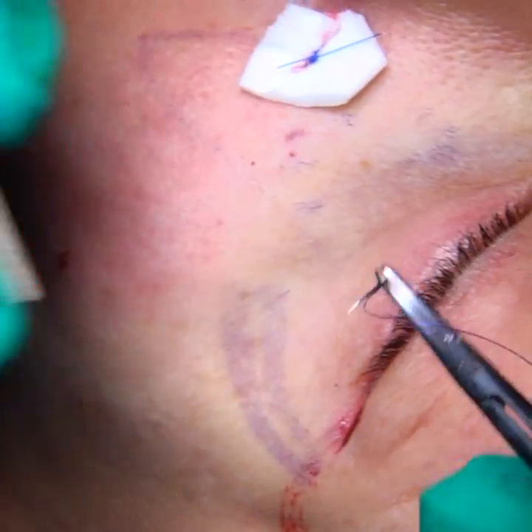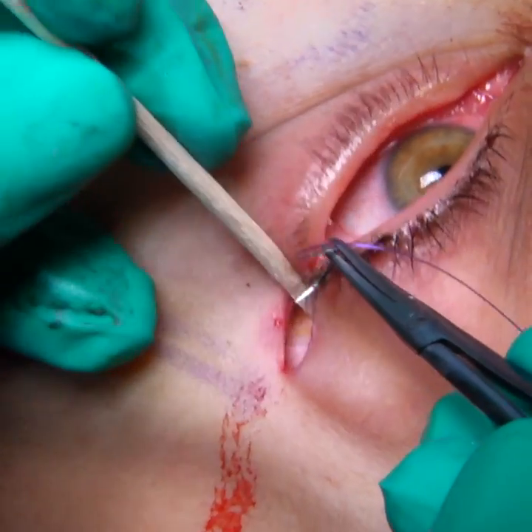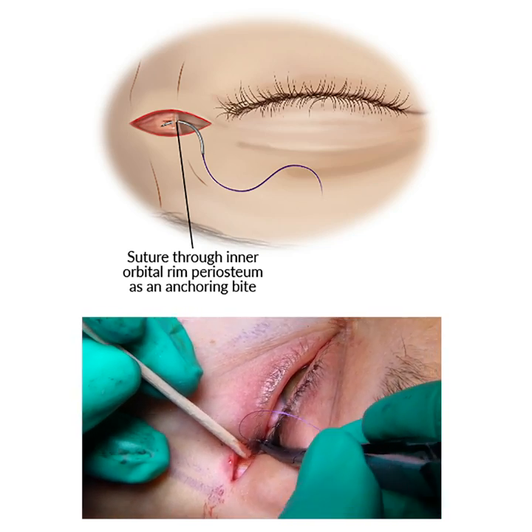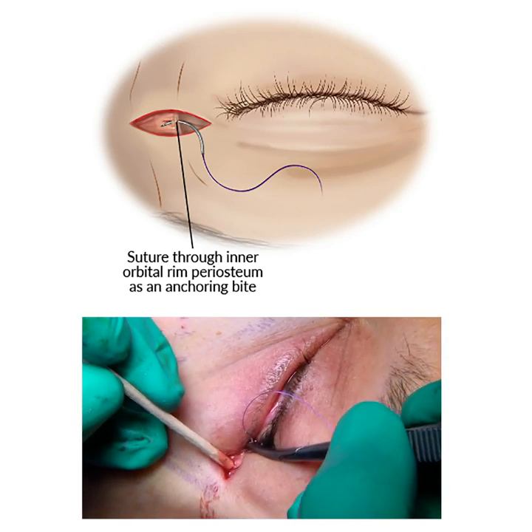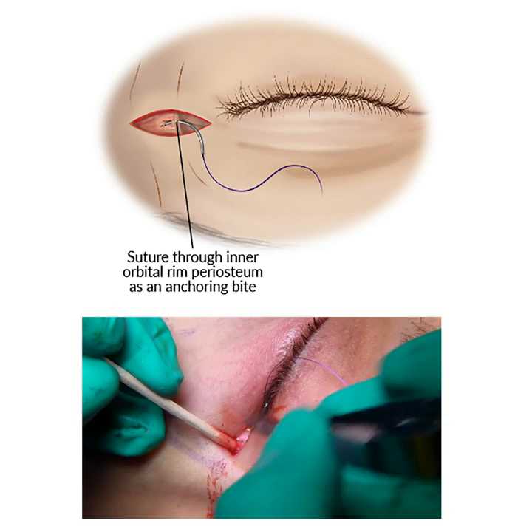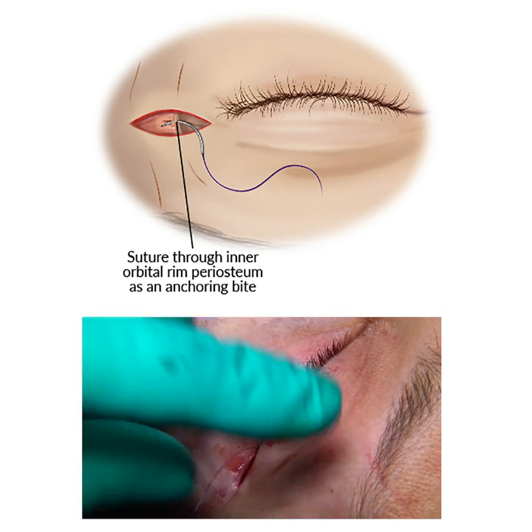So what I'm going to do here is expose the inner orbital rim periosteum, which is there, and then put the suture through. And that will be the anchoring bite.